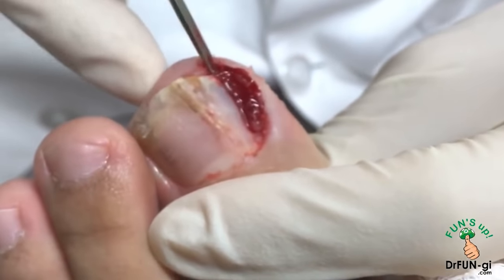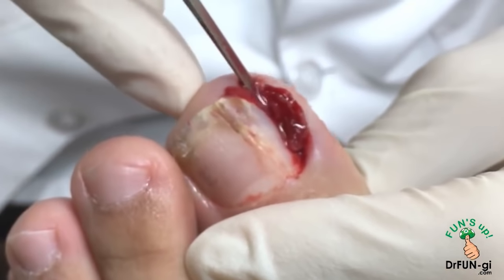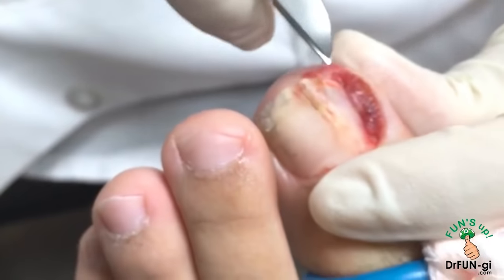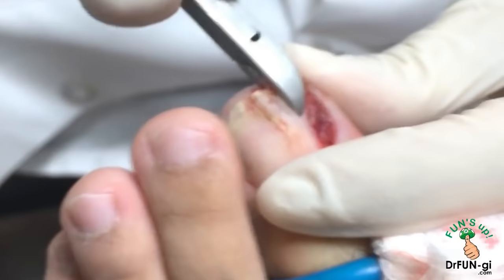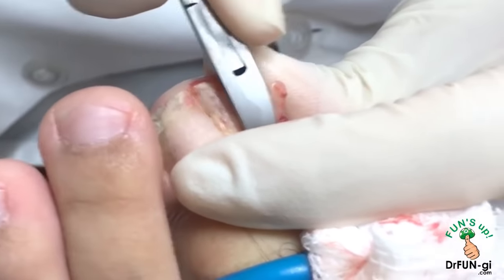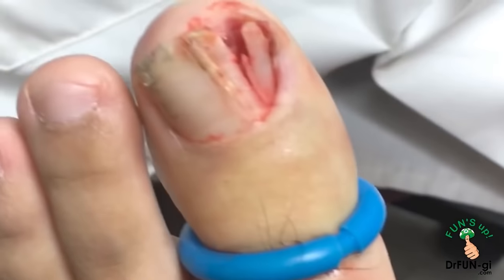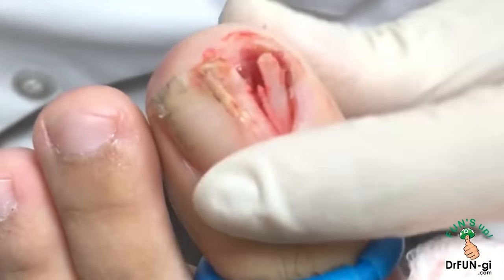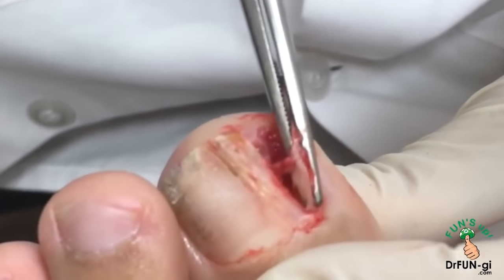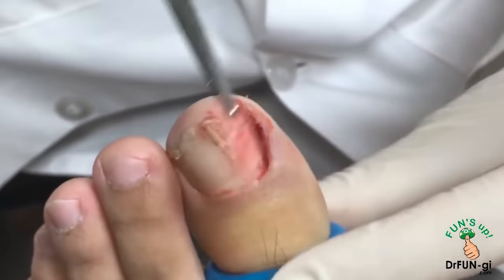Going underneath here, taking a good part of the chunk all the way down to the base of it — down to the base of the nail — and then grabbing this whole part out. This is a pretty good size nail, as you can see.